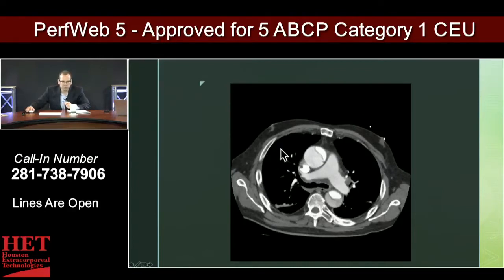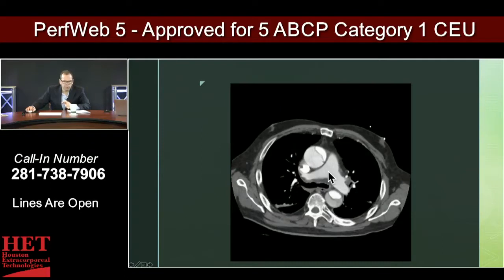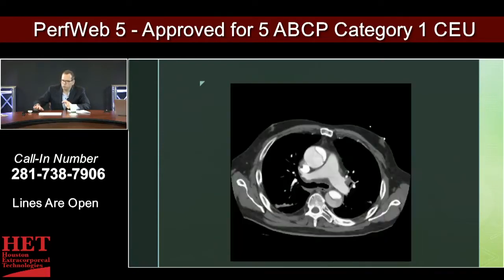But this specifically is a CT scan representative of an aortic dissection. In the heart, the aorta comes out anteriorly. Directly beside that would be the pulmonic valve and thus the pulmonary artery, which is here. These are highlighted in an angiogram or contrasted study, meaning you inject the dye peripherally and then wait for it to show up in the vasculature before taking pictures.